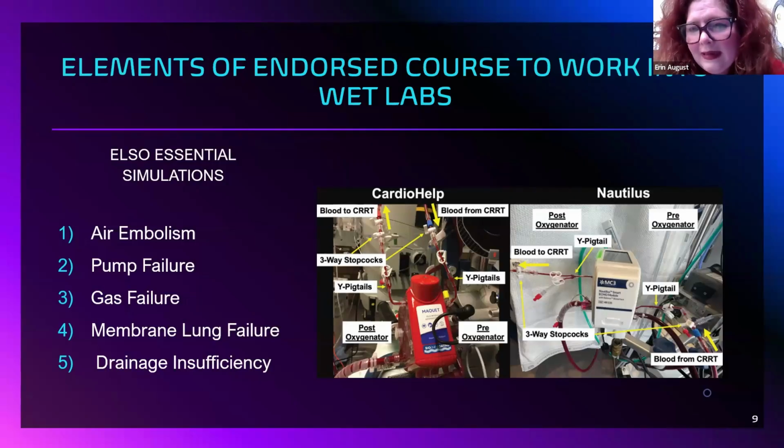You want to think about the mechanics and how do you handle each one of those. Because we talk a lot about hand cranking, but hand cranking is not for all consoles. So we have to be able to practice and know and time ourselves on how to change out equipment if it is a primary pump failure. So in addition to the wet labs and simulations, once you walk the team through these types of situations and get everybody comfortable, then it is time to time your team on how quickly can we change.